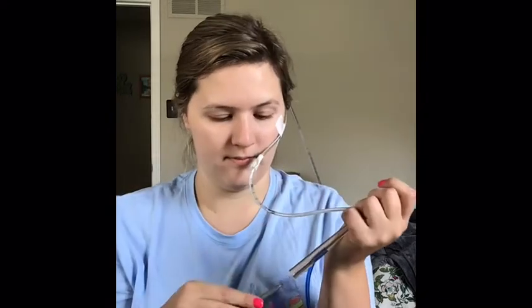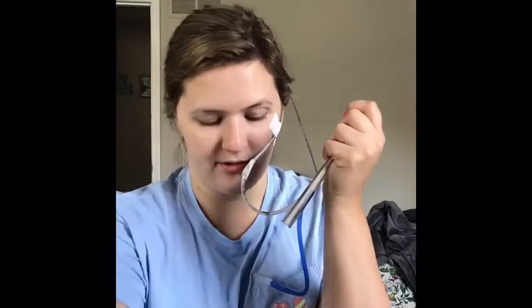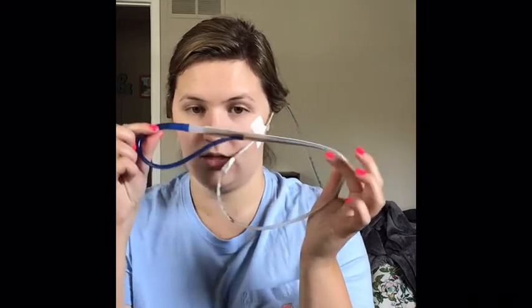So let's say this is my syringe and I'm going to pull back just a little bit, just a couple mils, and then I'm going to clamp it to take out the syringe. So I took out the syringe and I'm going to put it back so it's clamped, so it's closed now. And I would just test my pH. Stomach pH should be between 1 and 4. So I would do that with my pH paper, put it in a little medicine cup and test that. And then after, sorry, that was my self-identified break, I guess, because I forgot to say that.